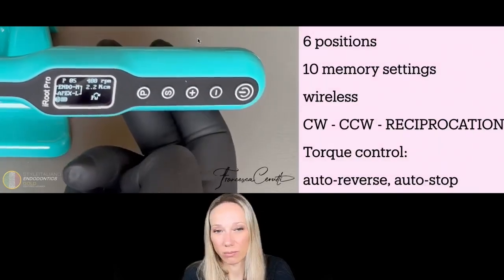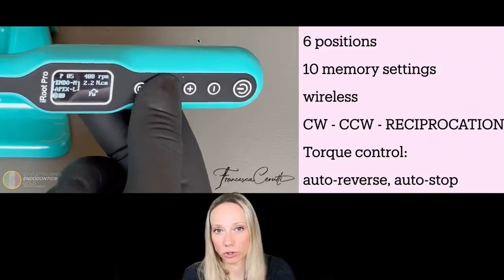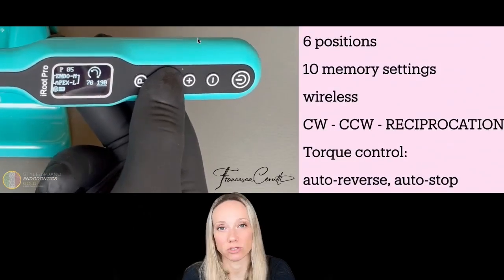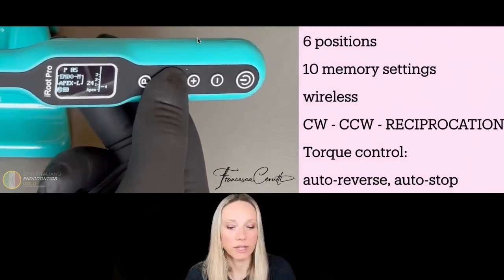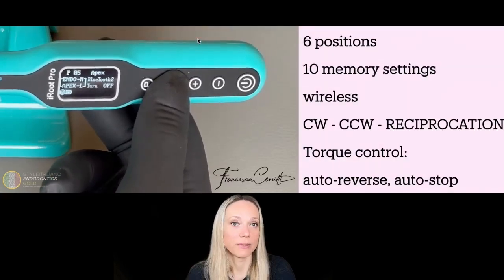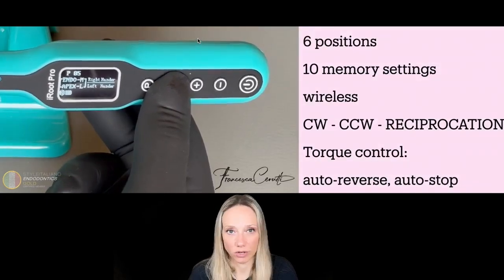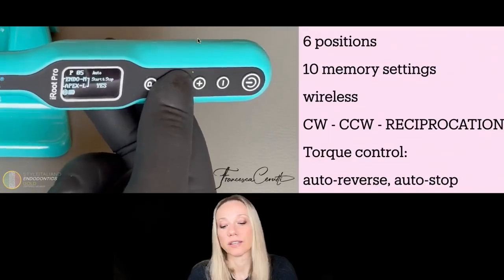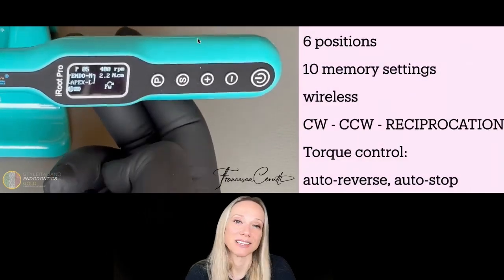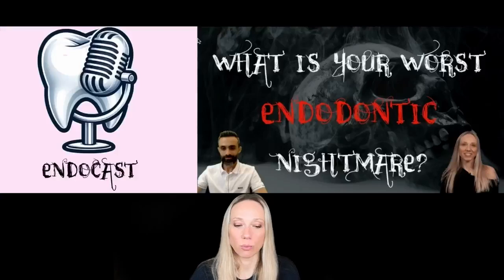So we can have our programs and we can switch from continuous rotation in a clockwise motion to the counterclockwise, and we can also have reciprocation, and we can set the angles of the reciprocation movement that we want. And always we are going to have the torque control. So we will be able to see in every moment which is the stress that our files are encountering inside of the root canal system. And then we can also set the auto reverse, auto stop, so we have some system that help us in being good in our shaping. And this is the endomotor.